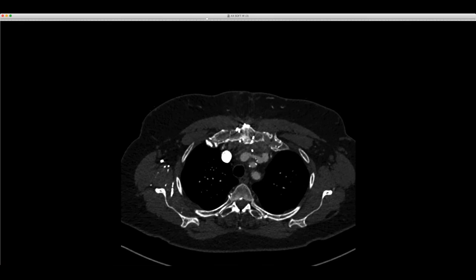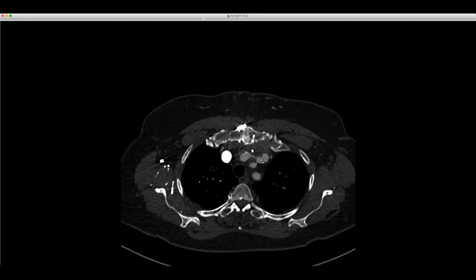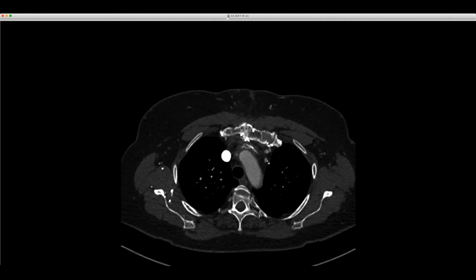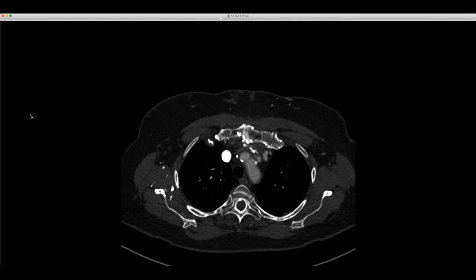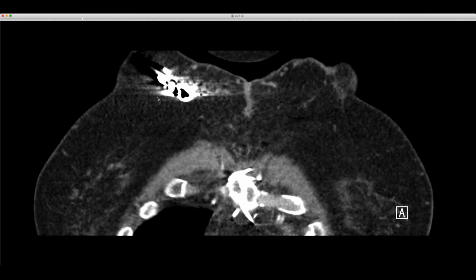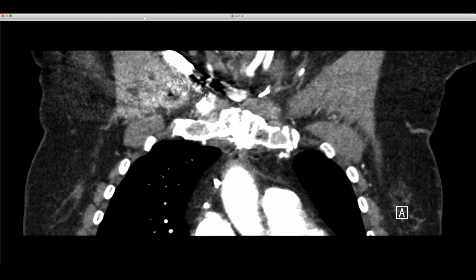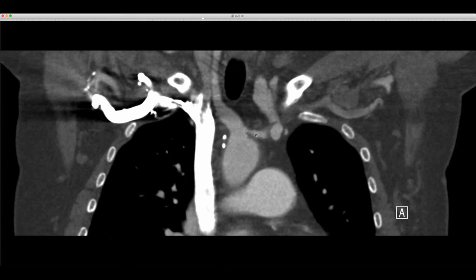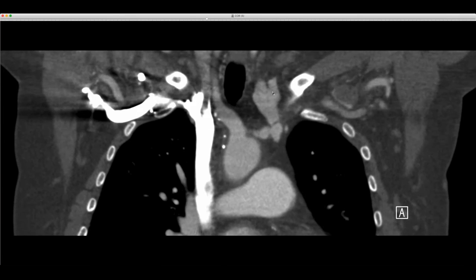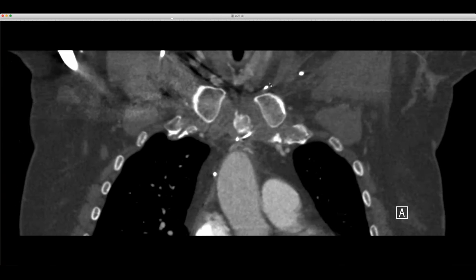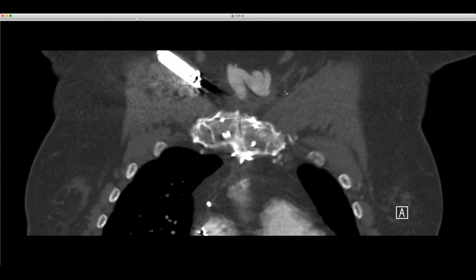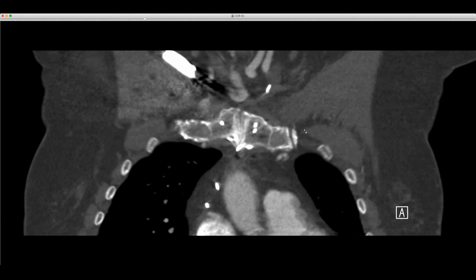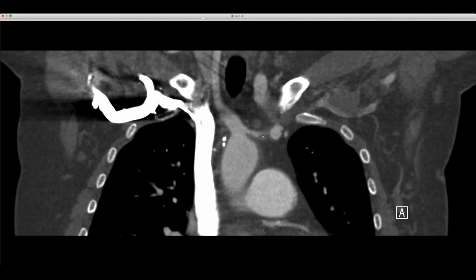This is a nice case of a fistula presumably created through pacemaker placement and manipulation between the brachiocephalic artery and the innominate vein. On the coronal, you can see the fistula right here, and all these varices light up — not only the jugular, but also some varices in the anterior neck due to this possibly high-flow fistula. I just thought that was an interesting case.